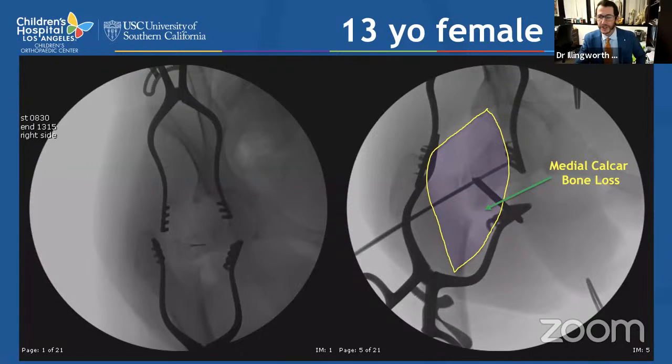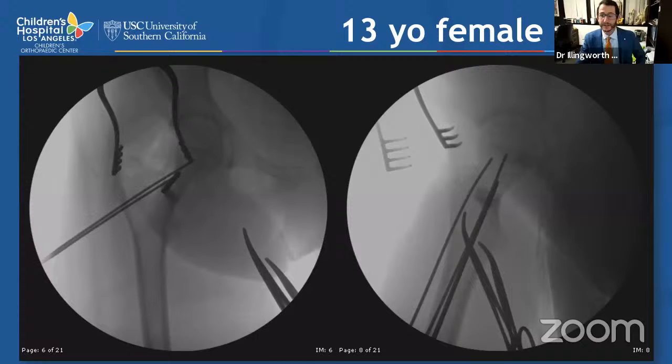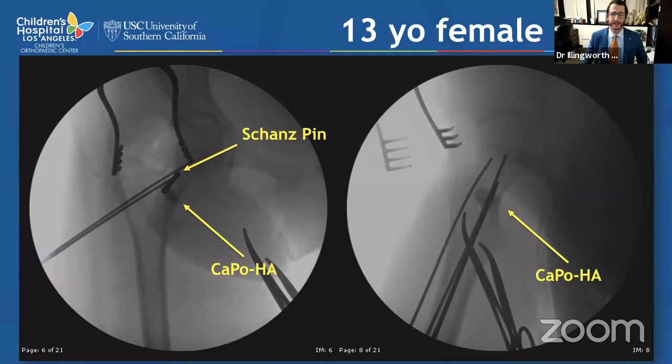We can also appreciate she has a lot of medial calcar bone loss and comminution there, which again, are high alert, high flags for potential for varus collapse and varus failure in my hands. All right, so here on the left side, this is after we obtained what we considered to be an anatomic reduction. You can see a few things on this particular slide.